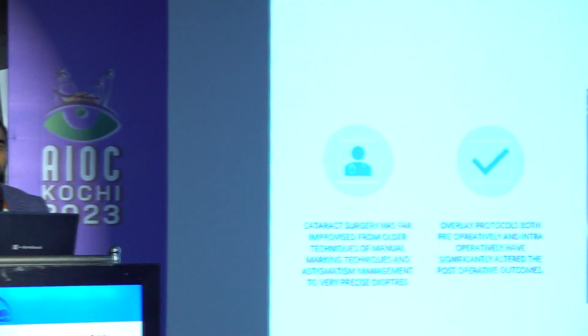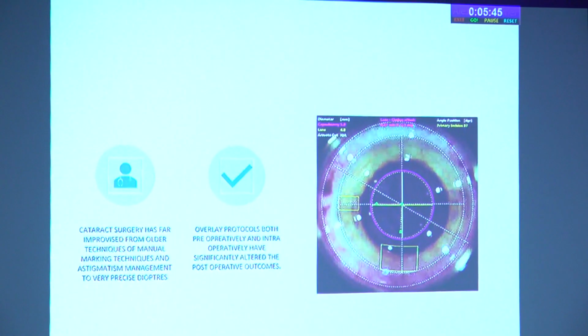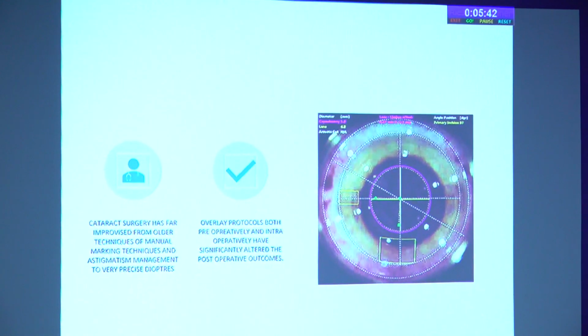Hi, good morning. I'm just going to brief you about the different intraoperative imaging techniques that we have today in our surgical armamentarium. As we know, the demands of our patients, especially in cataract surgery, are constantly increasing. This intraoperative imaging can take our accuracy and precision one step further and give you an edge when performing your cataract surgery. Essentially what this does is it helps you plan your toric IOLs.